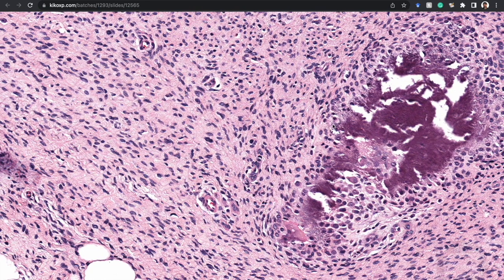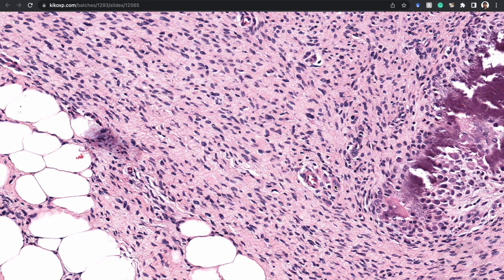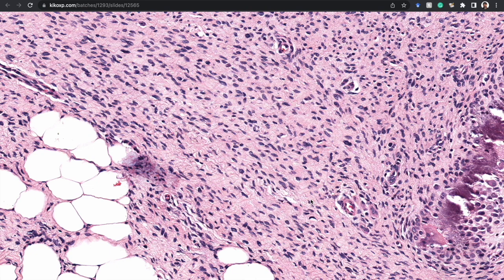...and then here, coming out away from those islands, you get bland spindle cells that are arranged in long, sweeping fascicles — kind of like the features you'd see in a desmoid fibromatosis, only on a much smaller scale.